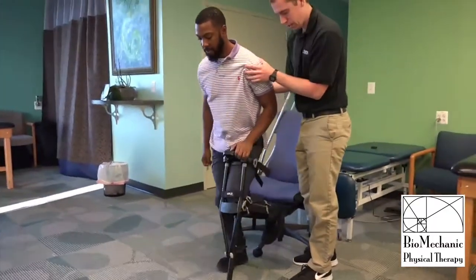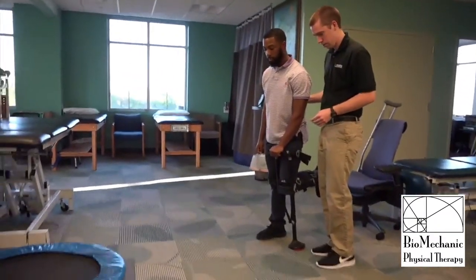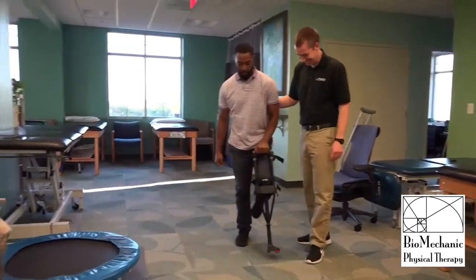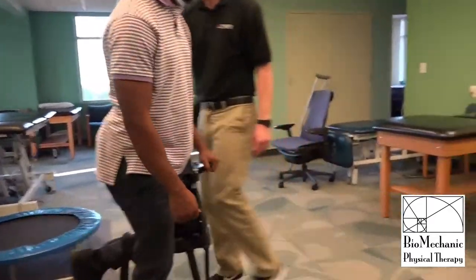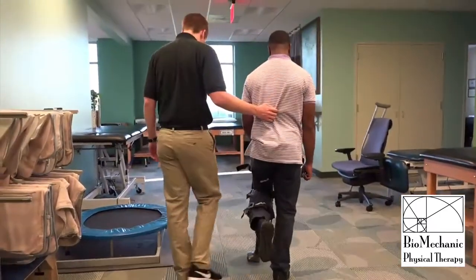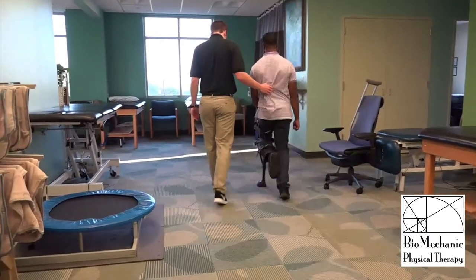Now Dion's heading out for his first try but he's not going to use a crutch. Do you want your crutch? Doing pretty well. Keeping Danny close by in case somebody loses their balance.